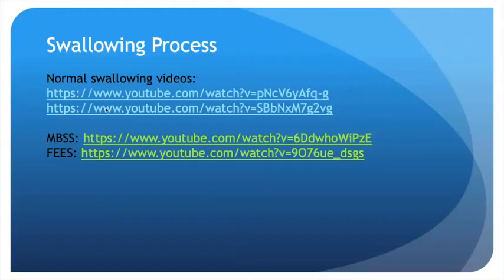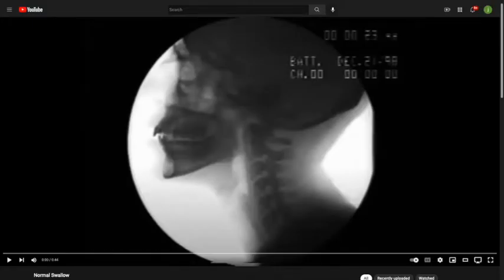The second video here is a little bit longer. It's about 9 minutes, so we'll let you play that one at your leisure. And this is a normal swallow. We're looking at a modified barium swallow study.